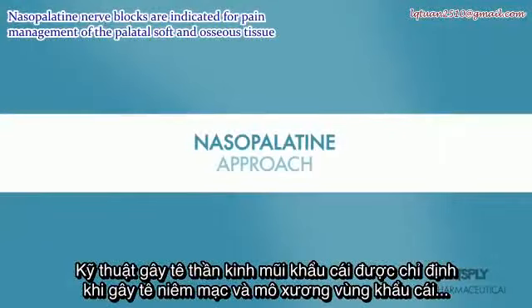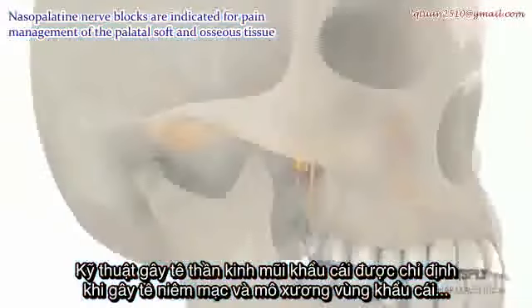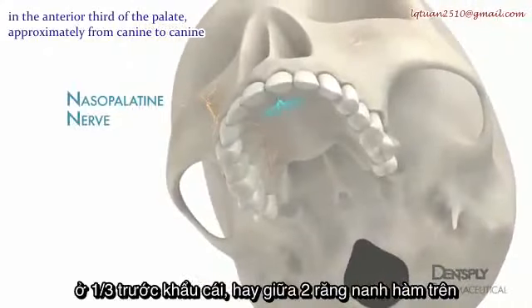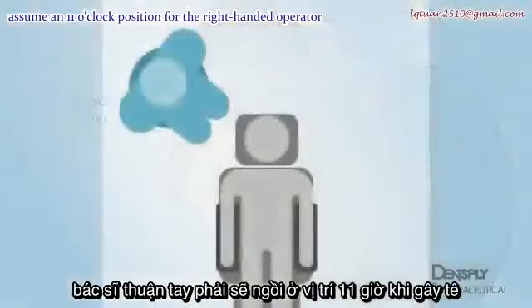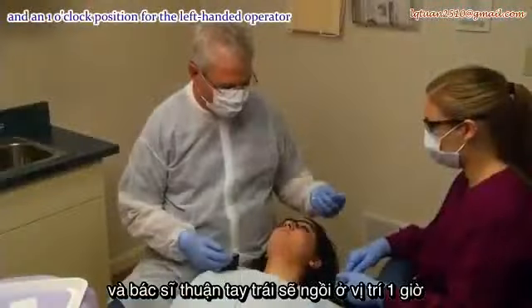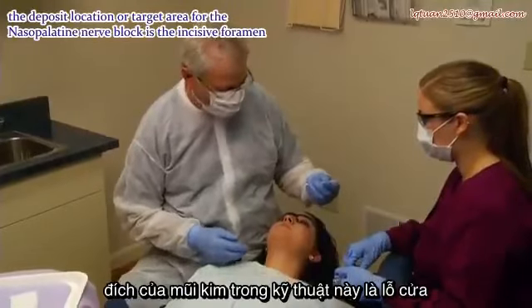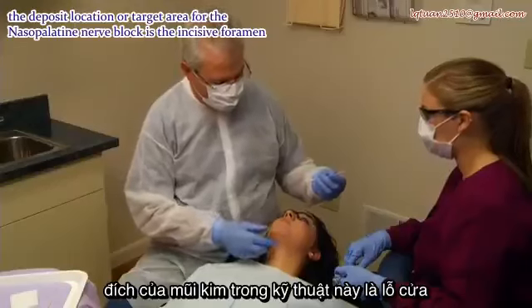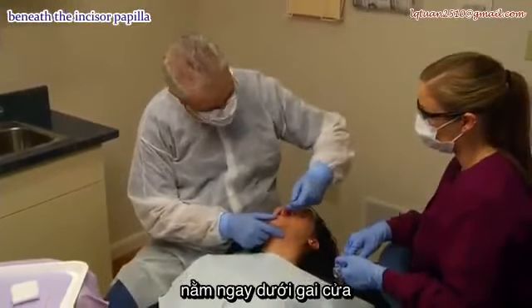Nasopalatine nerve blocks are indicated for pain management of palatal soft and osseous tissue in the anterior third of the palate, approximately from canine to canine. Assume an 11 o'clock position for the right-handed operator and a 1 o'clock position for the left-handed operator. The deposit location or target area for the nasopalatine nerve block is the incisive foramen beneath the incisive papilla.